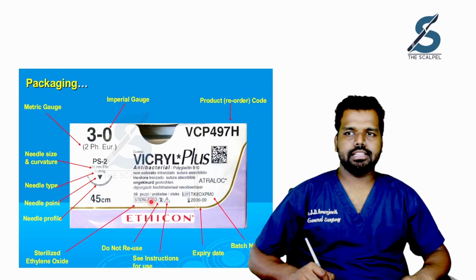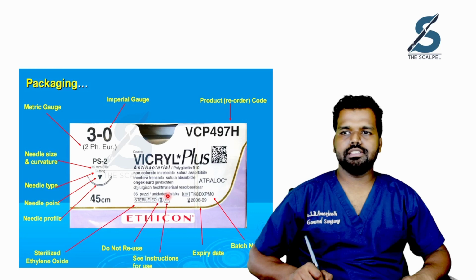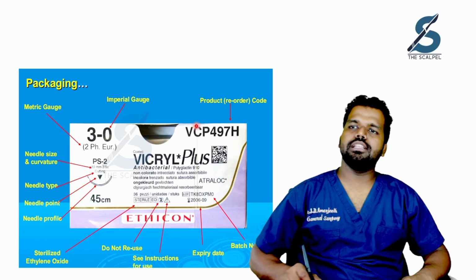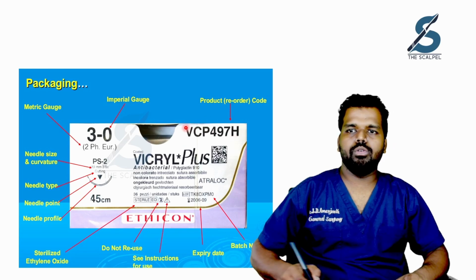EO means ethylene oxide. This denotes that this is not reusable, and here it shows to see the instructions for use in the sachet inside. And this is the expiry date of the suture material, this is the batch number, and this is the product code. If you want to order the same suture material again, you should use this product code to order it.